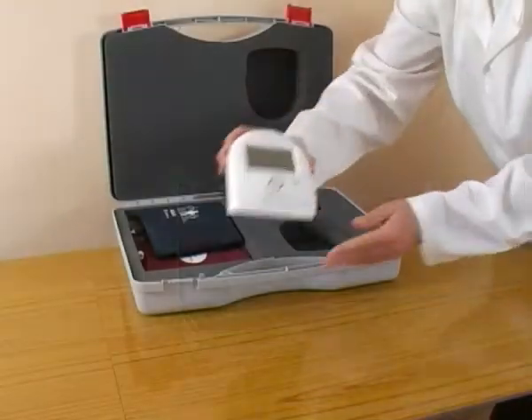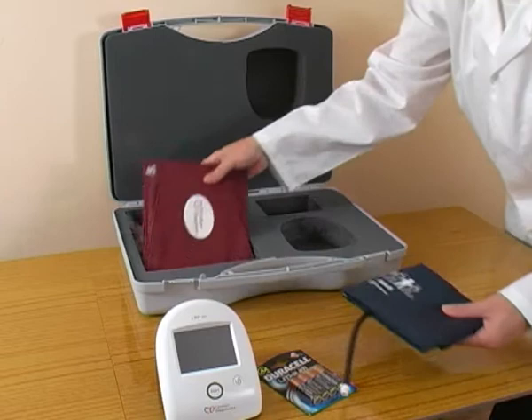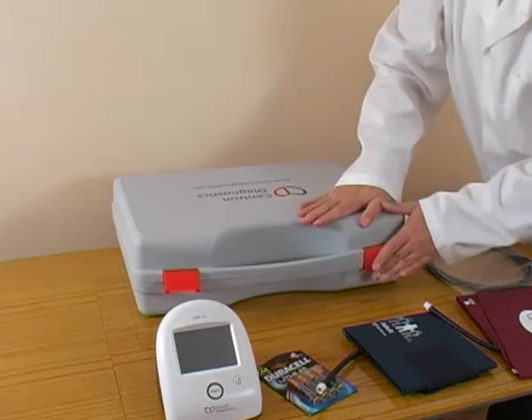The main instrument, the batteries, both standard and large arm cuffs, the connecting hose, and the operating manual.